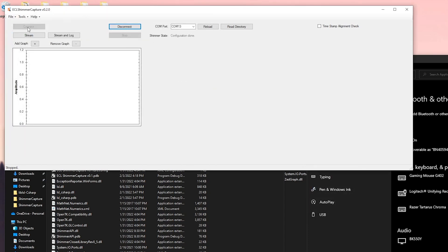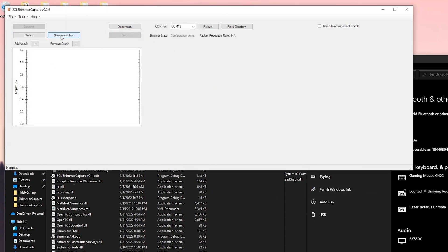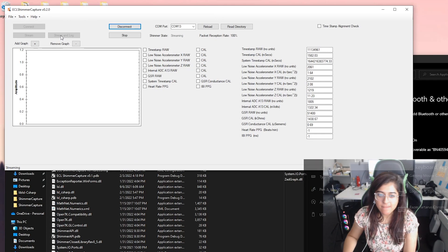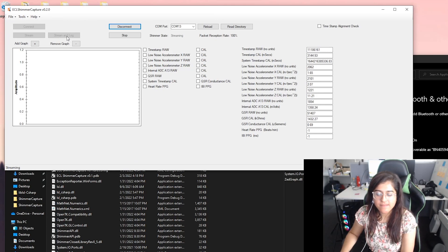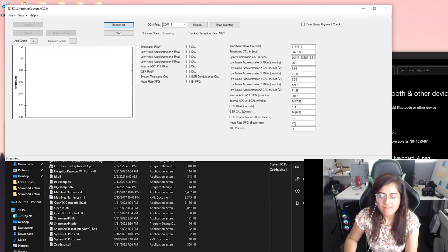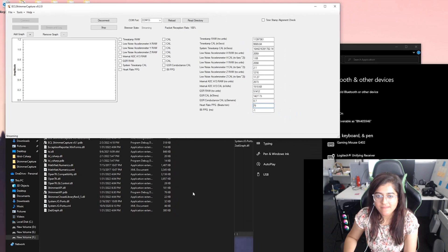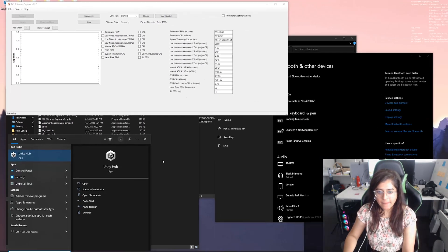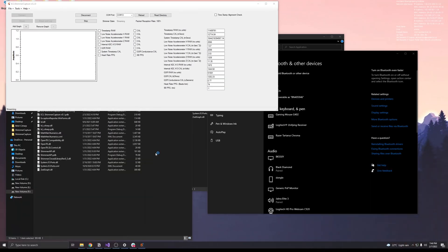You can LSL stream as well. Click on stream and log and it's going to calculate the heart rate of the person along with all the other information. To show this information in Unity, click on a sample Unity LSL application.